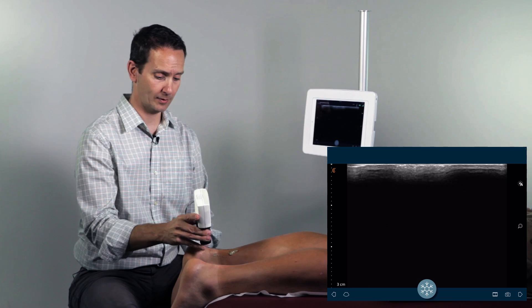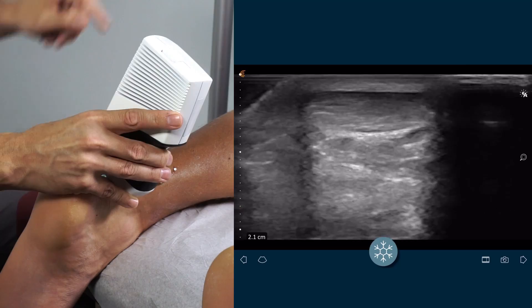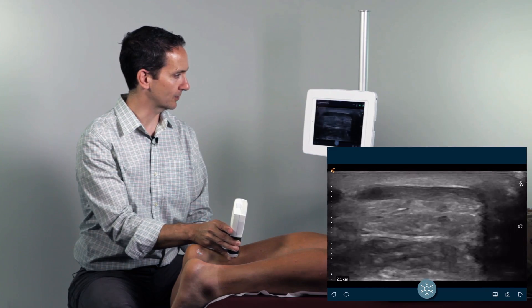You'll also want to assess the tendon in transverse. Rotate the probe 90 degrees, identify the tendon, assessing it down to its insertion and all the way up to the myotendinous junction.